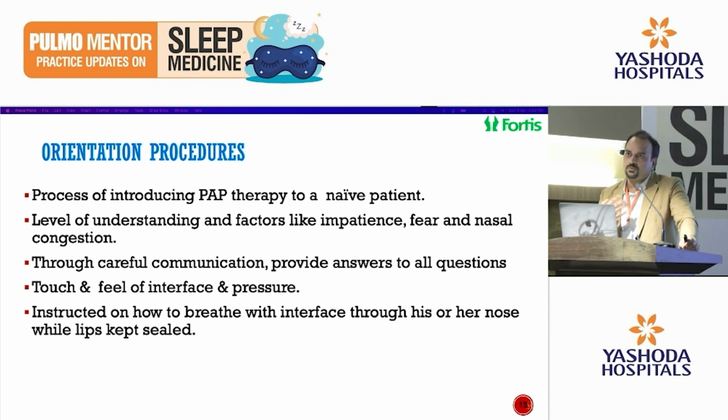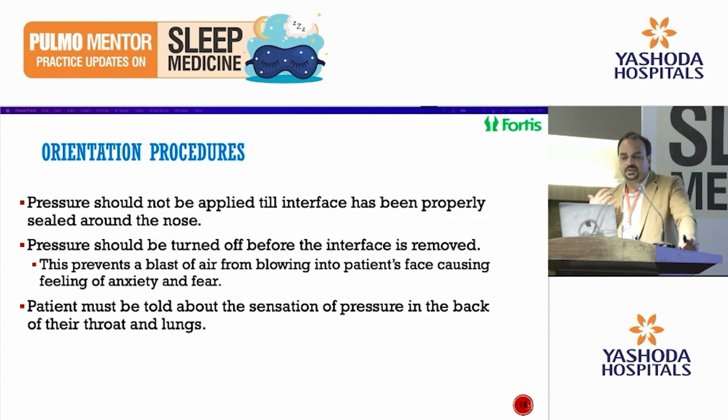You need to counsel your patient, make them aware, keep them in confidence that this is going to help them out. Thorough, careful communication, providing answers to all of your patient's questions, is very, very important. You need to give them a touch and feel of the device, so they know this will not harm you. This will not create any problem while you are sleeping. Instruct them how to breathe in the interface. Once the patient applies this CPAP or PAP therapy, there is a gush of air. So patients sometimes get frightened after it.